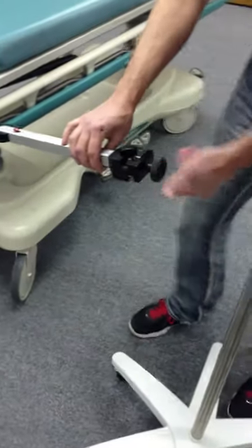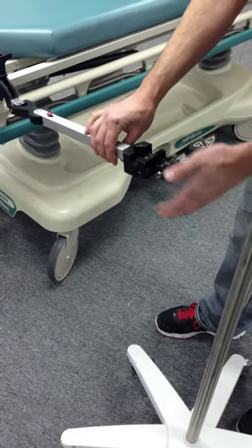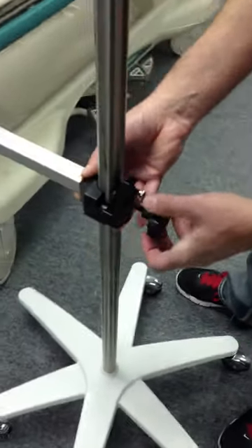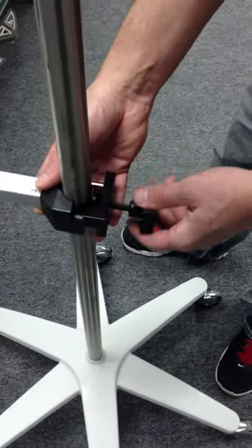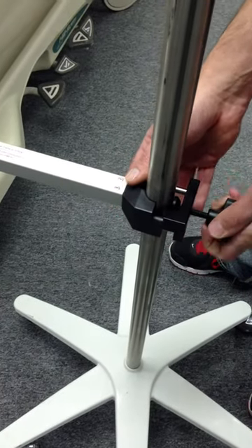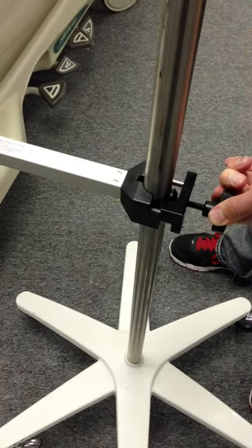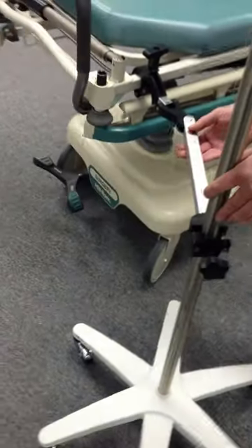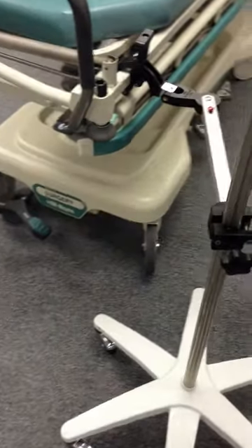Now you can just take your IV pole, slide that in. Once again, you want to keep that in line, like level. And it's connected now. And now you can move your pole wherever you want by simply pressing the spring-loaded button.